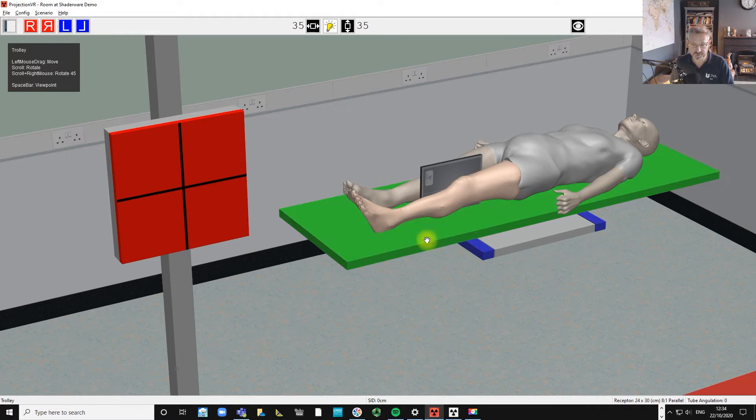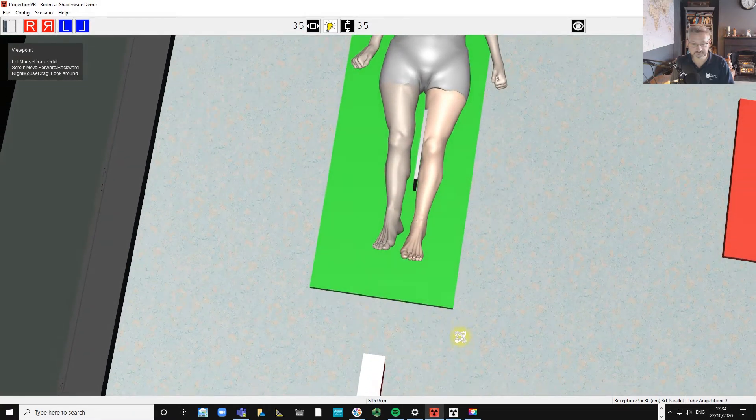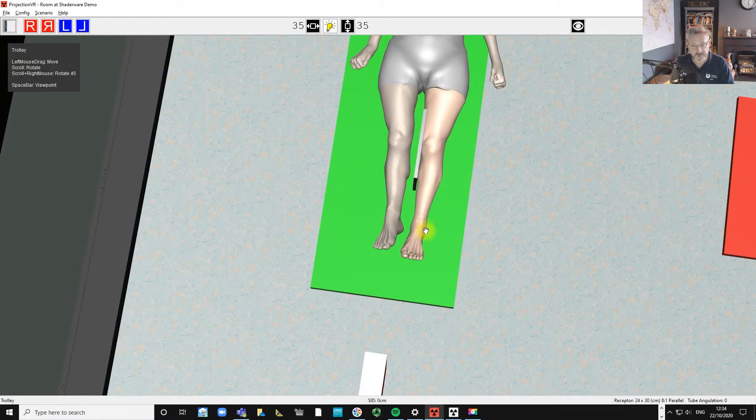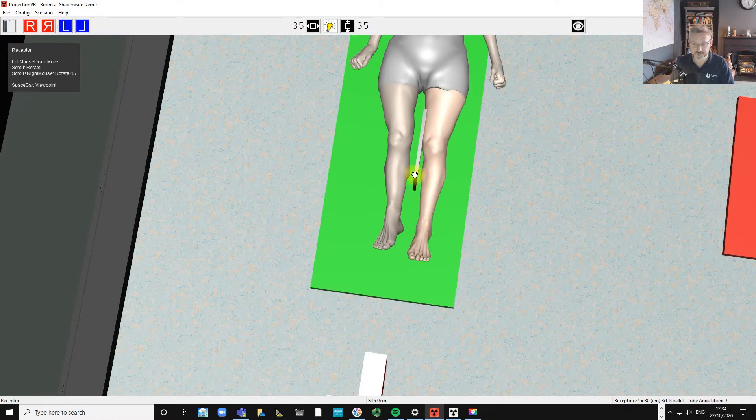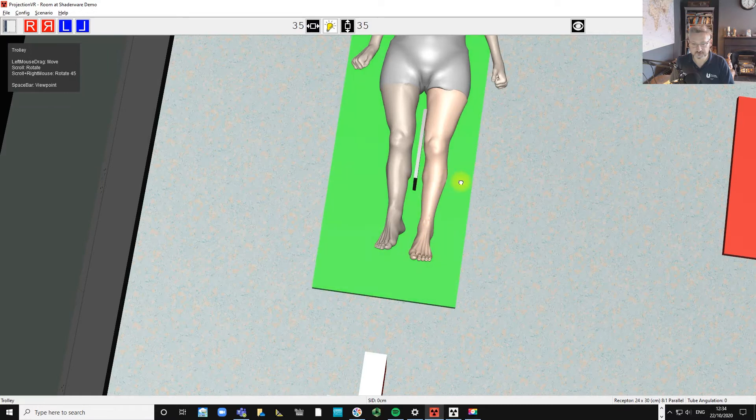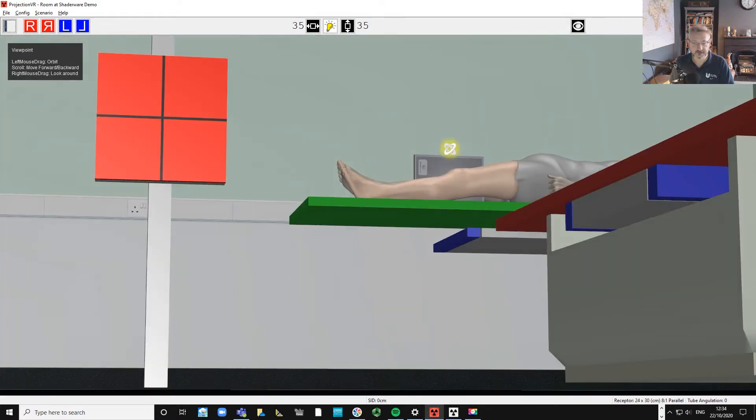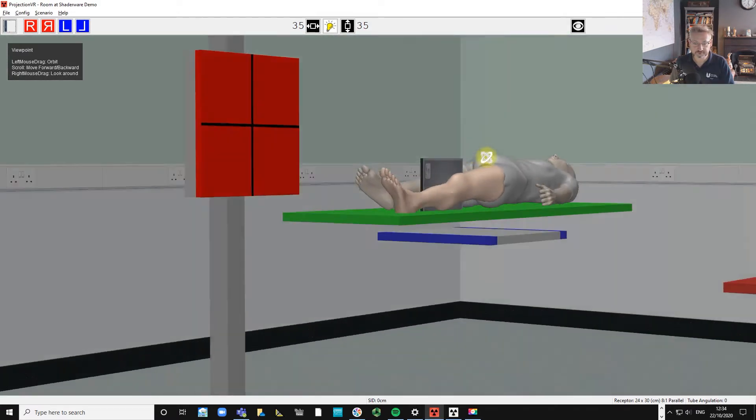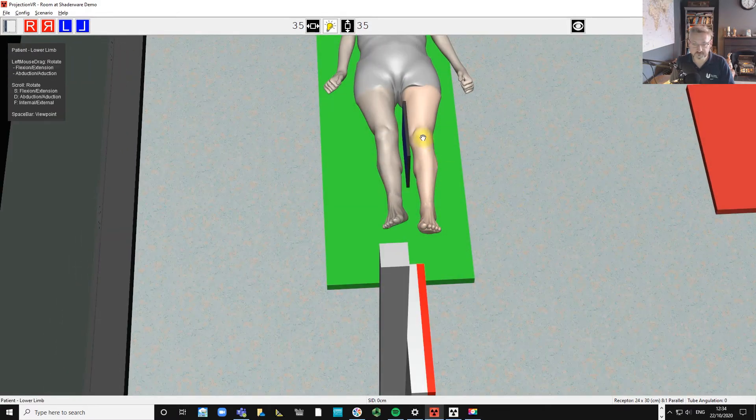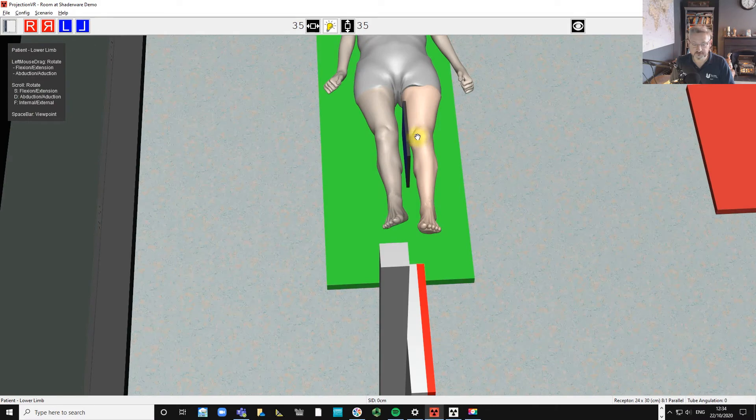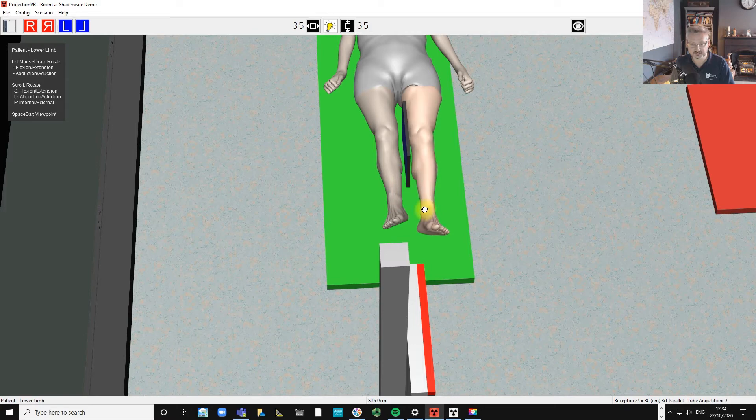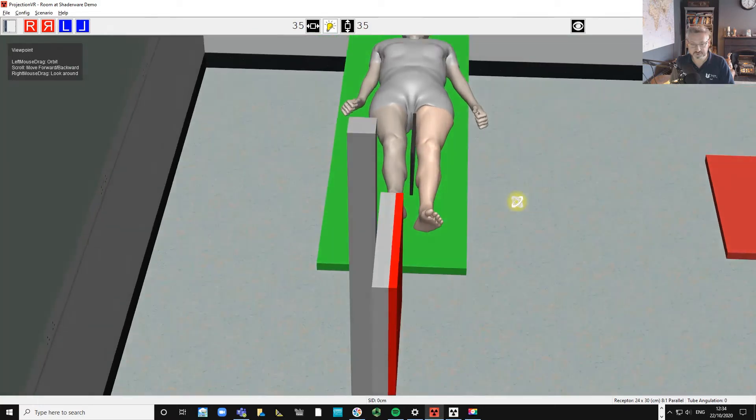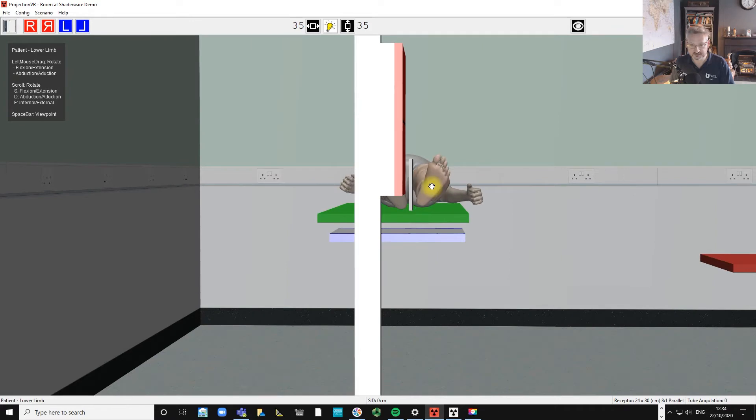So we're going to put the receptor between the patient's knees and then we're going to abduct the limb slightly. It's important that we get the condyles to superimpose one on the other and to get the knee in a lateral aspect. The ankle needs to be externally rotated. So a common error is not to externally rotate the limb enough.